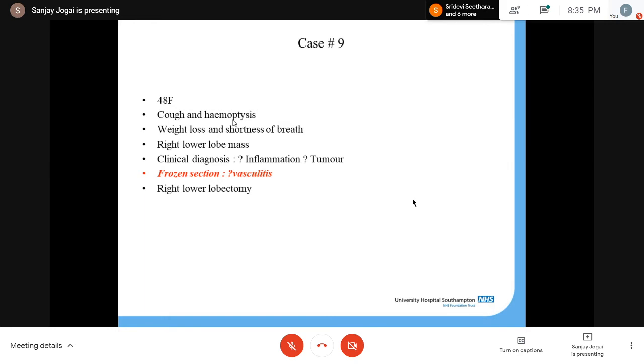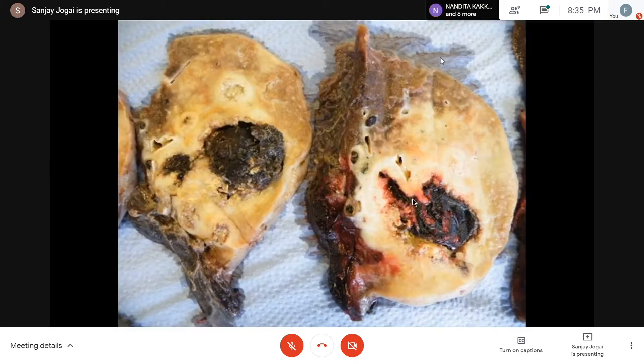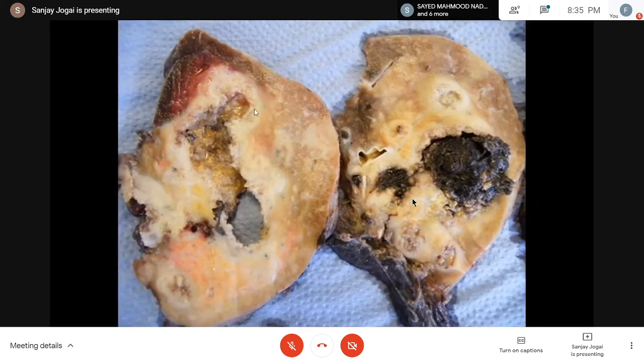And the reason for that was the lungs look like this. Just imagine the whole lung. It was these very, very hemorrhagic looking lesions with bordering areas, quite necrotic, multiple such lesions in the background as well. This is another focus. Almost demarcated areas of necrosis with central sort of falling off, blood clot.